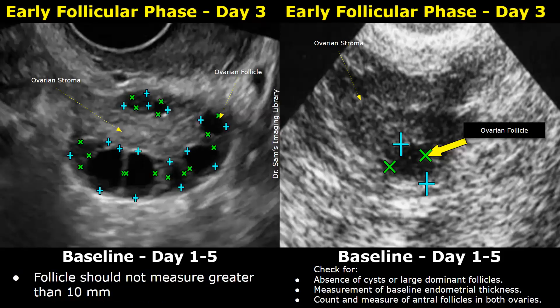You need to take at least two measurements of each follicle and then determine its mean diameter from those two measurements. During the baseline scan, a follicle should not measure greater than 10 millimeters.